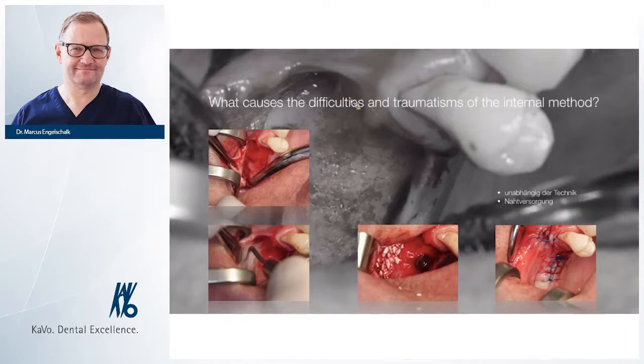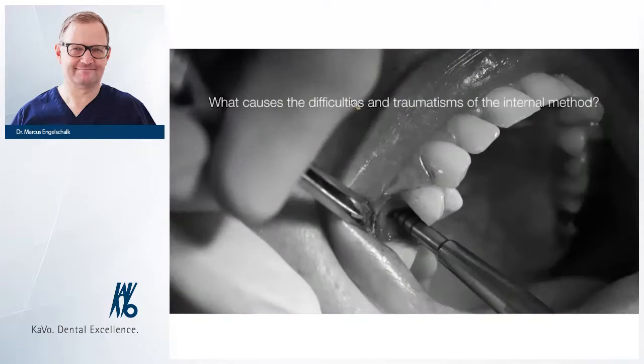The rest should be very minimal invasive because the entrance to the operation site is very small. You just cut on the alveolar ridge and you will go through a small hole, mainly the diameter of 2 or 3 millimeters, where you have the entrance through the bone into the sinus. Well, the question is, minimal invasive is very important for the patient, for the healing period, for the time after the operation. But for us, more interesting is safe entry and significant elevation.